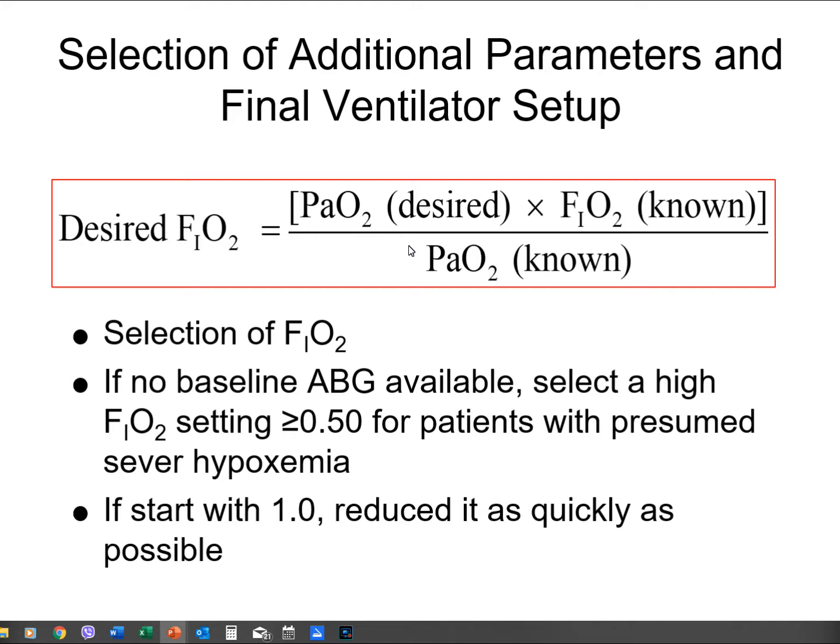If you have a doctor who says the blood gases look kind of bad on the oxygen side, all you've got to say is, Doc, what would be your desired PaO2? Let me put it this way: if your PaO2 is low, let's say it's at 50 and the doctor wants it at 80, it ain't going to happen. I'm going to have to crank up that FiO2. So the desired has to be reasonable.